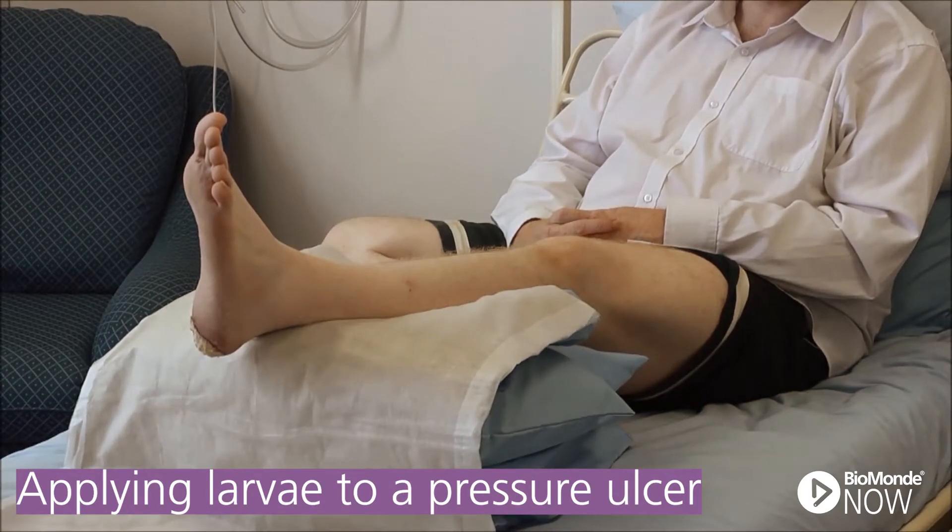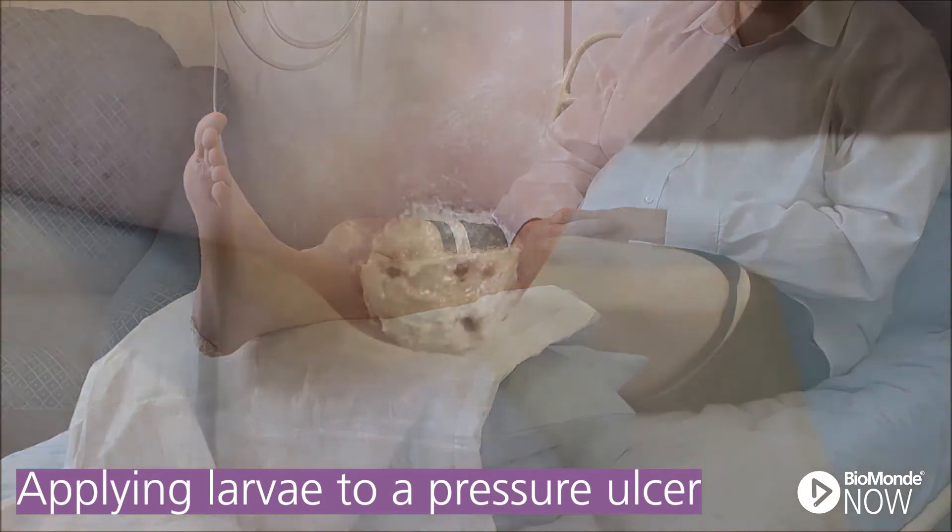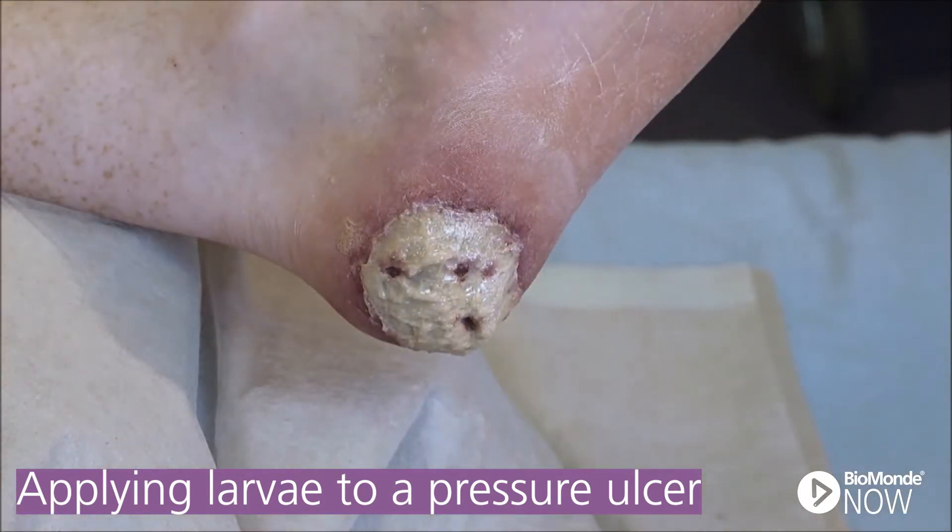Applying bagged larvae to a wound is a quick and straightforward procedure. You are about to see bagged larvae being applied to a pressure ulcer located on a patient's heel.